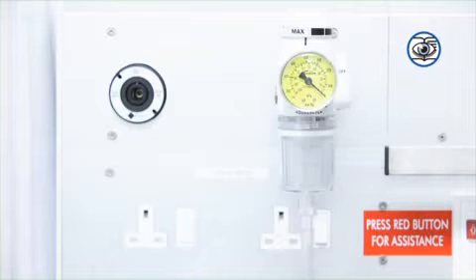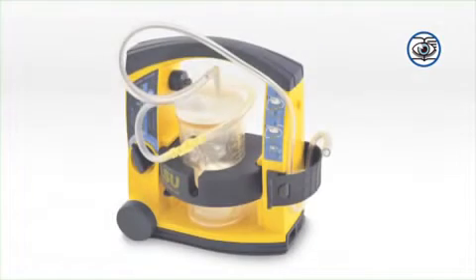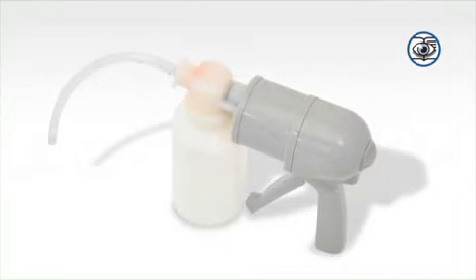vacuum. Just like oxygen, there are a number of ways of providing this vacuum, which will be dictated by your own circumstance. There are three main types. 1. A wall-mounted vacuum line where negative pressure is generated centrally, usually in an acute hospital setting. 2. Portable electric suction devices, which are battery or mains powered and generate their own vacuum. 3. Hand units, which rely on squeezing a trigger and series of non-return valves to generate a vacuum.